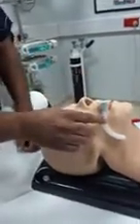airway. This is the Guedel's airway, the oropharyngeal airway. How to measure it? This is the important thing. The rule is angle to angle. This is the angle of the mouth and this is the angle, so angle to angle. The angle of the mandible, the angle of the mouth. This is the appropriate size.